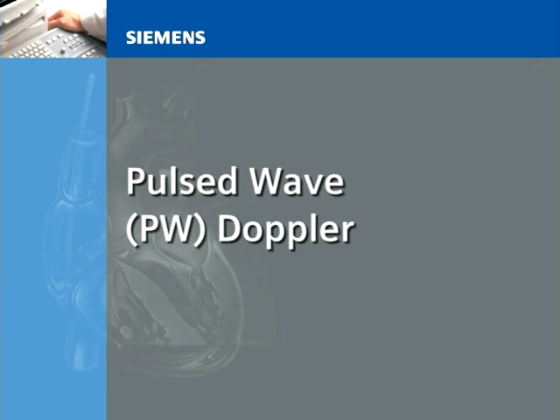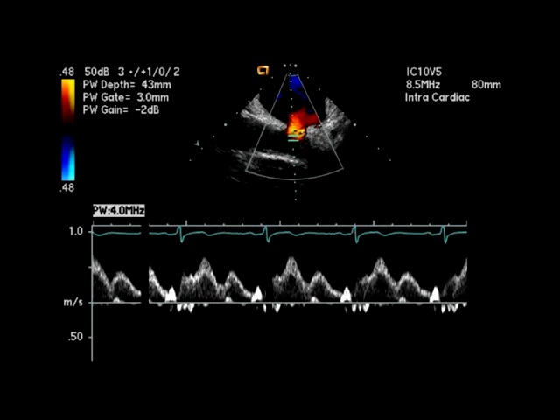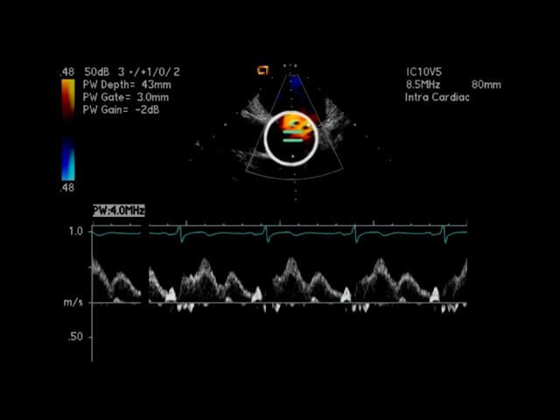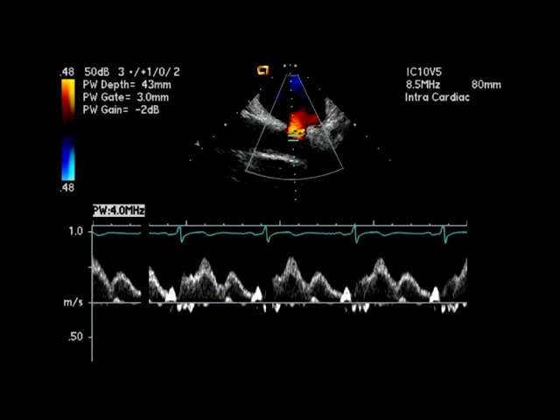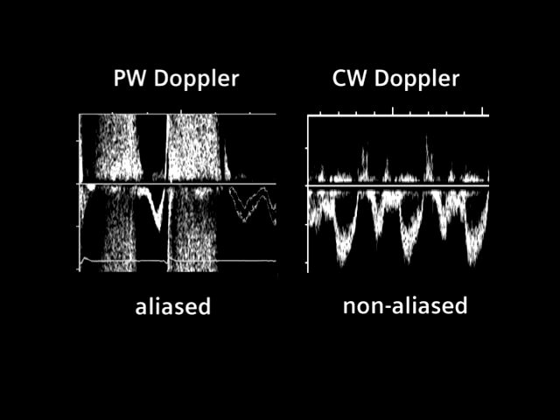Pulsed Wave (PW) Doppler. The PW Doppler signal shown here is being used to evaluate the blood flow within a pulmonary vein. PW Doppler measures the frequency shift in a small volume of cells contained within a sample gate, making it possible to selectively study the velocities within different cavities and valve areas. The maximum velocity that can be measured using PW Doppler is limited because of a phenomenon called frequency aliasing, which can be observed in various cardiac conditions that produce very high velocity blood flow.